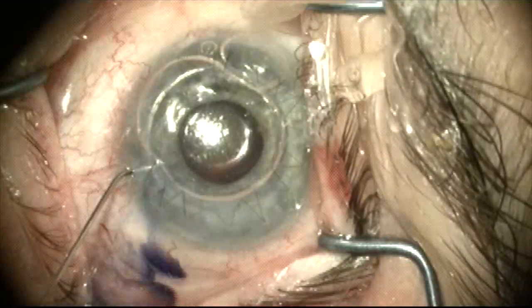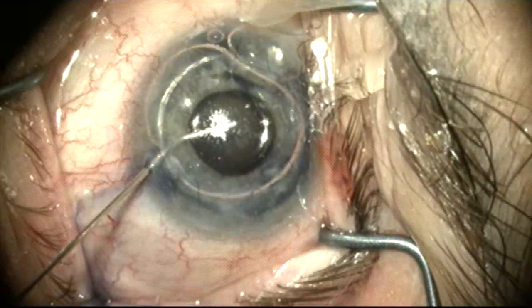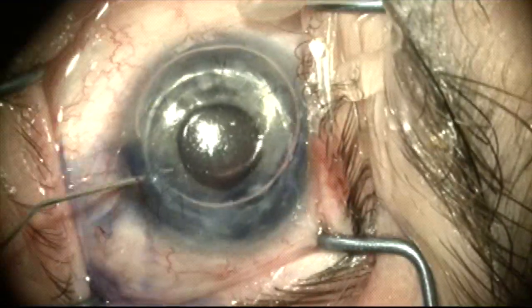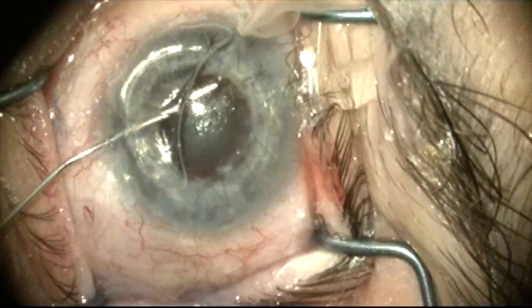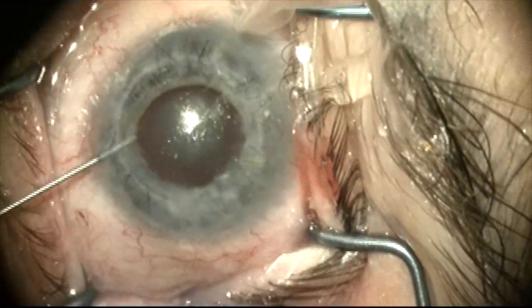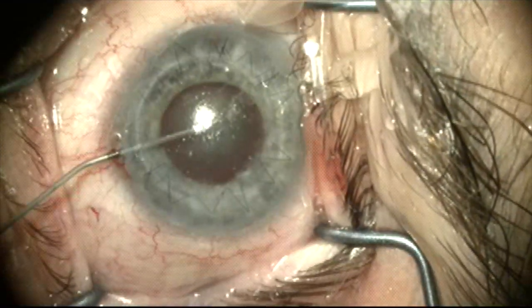We're going to stain the anterior capsule with Vision Blue and then perform the capsulotomy. These large congenital glaucoma eyes tend to have flimsy capsules, weak zonules, and some anatomical abnormalities relative to normal eyes.